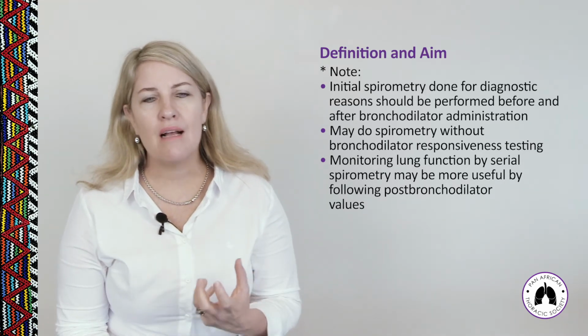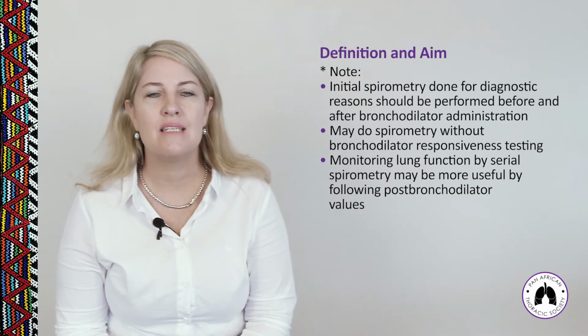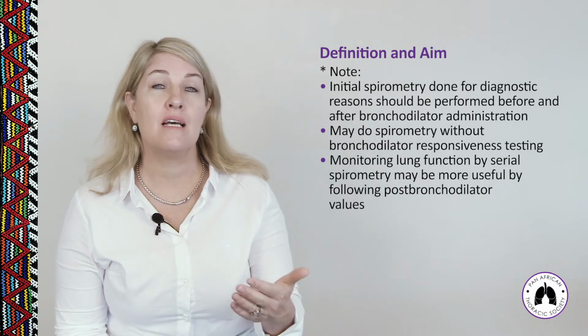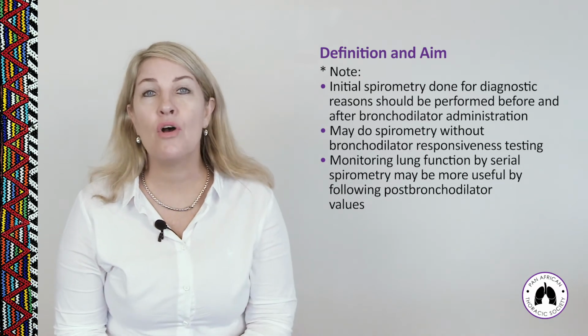And you should monitor lung function by serial spirometry, especially in patients with obstructive lung disease. But it may be more useful to use the post-bronchodilator test result to actually do that monitoring of the lung disease over time.